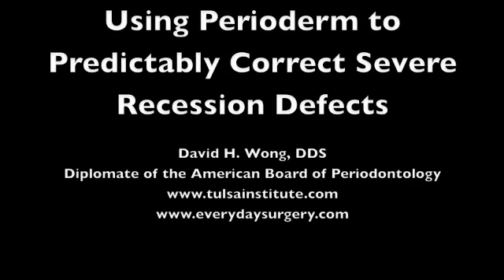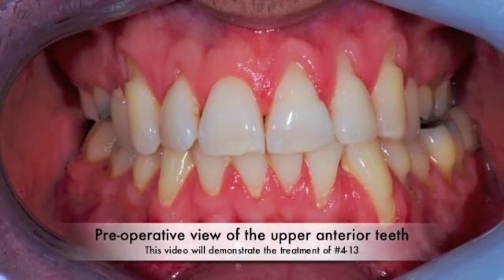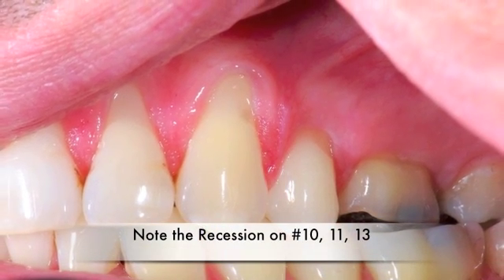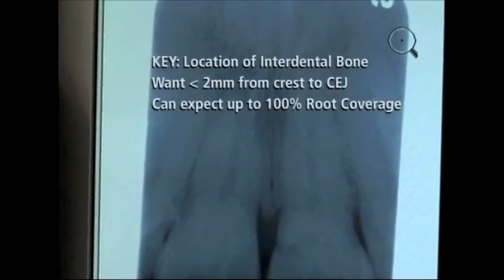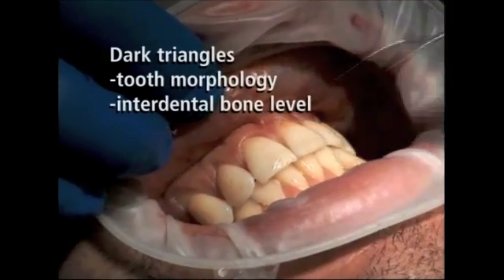In this short video, I want to demonstrate how a material called perioderm is being used to treat multiple moderate to severe recession defects in the maxillary arch. The teeth being treated are teeth numbers 4 through 13. A radiograph is important because the level of the interproximal bone is the ultimate determining factor in the predictability of the percentage of root coverage that can be accomplished with root coverage procedures.